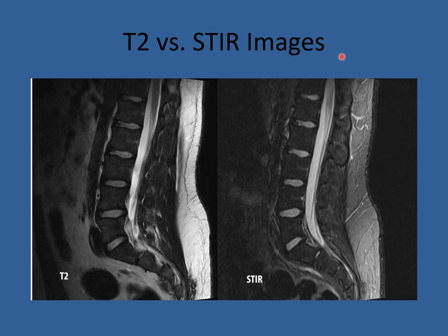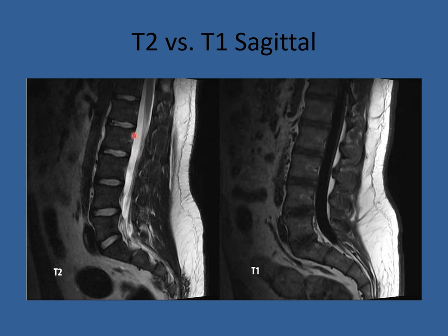There are three different images you'll be reviewing: T1 images, T2 images, and STIR or inversion recovery images. They all revolve around whether water and fat appear as bright signal or dark. On a T2, water is white — you'll see the spinal canal CSF is white, intradiscal water is white, and fat is white. On the STIR image, water is still white, but fat turns dark. On a T1, water is black but fat is still white.